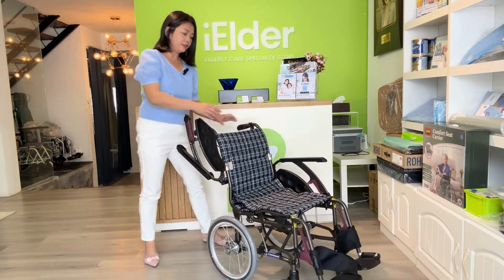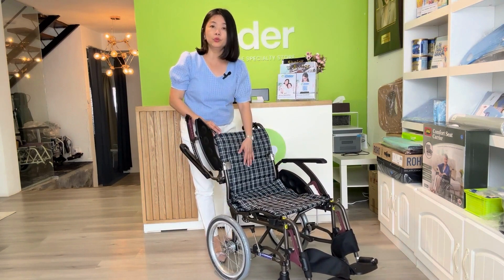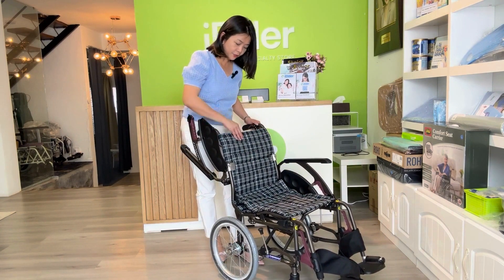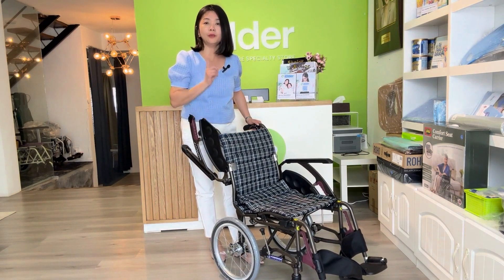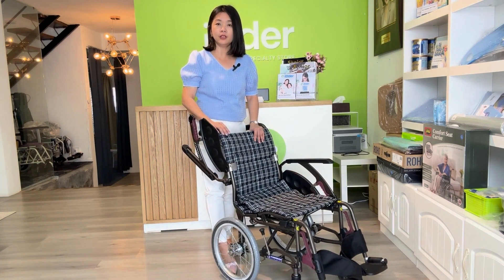Now we come to the fabric. They come in two colors — this is the dark blue, and we also have cream color. You can see the fabric here is very high quality material. But most importantly, this fabric is rip-resistant, antibacterial, and also machine washable.